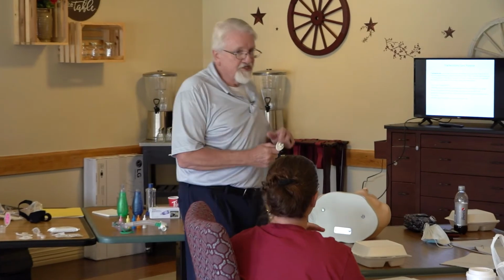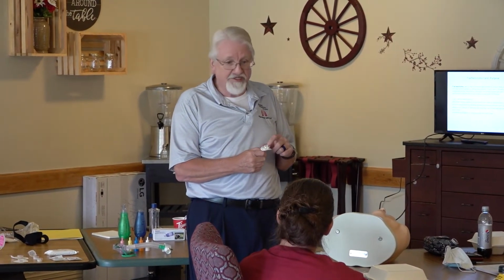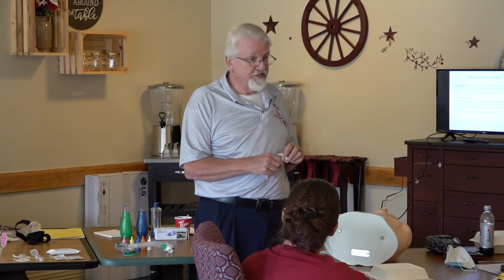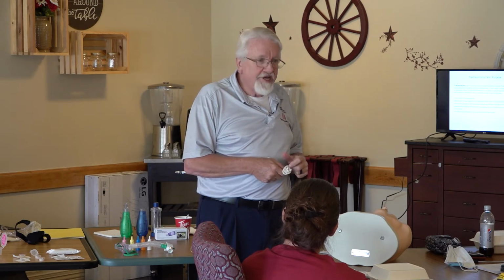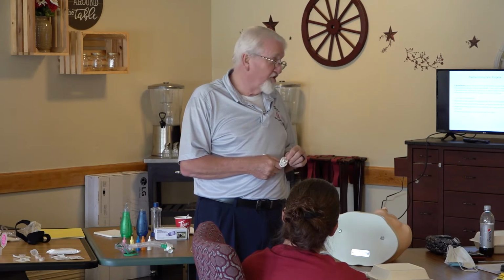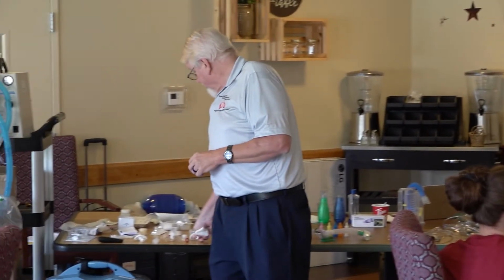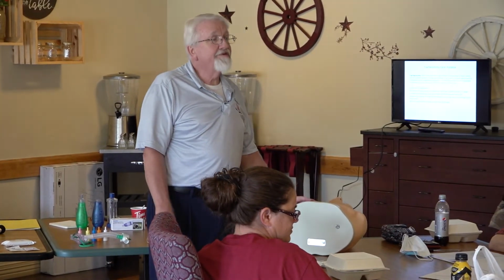And the time you let this go without being cleaned for a week or whatever, and everything is crusty and built up, is going to be the day the doctor calls you, 10 o'clock at night, and he's going to say, what kind and size trach does Miss Jane Doe have in? You run in there, oh, guess what? Nobody's cleaned that in a week. So you're tying up your time and the doctor's time, trying to get all this crust scraped off of there so you can see what the numbers and the size are. Again, all this stuff I'm sharing with you has happened.